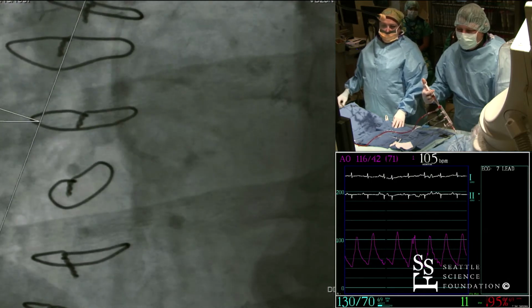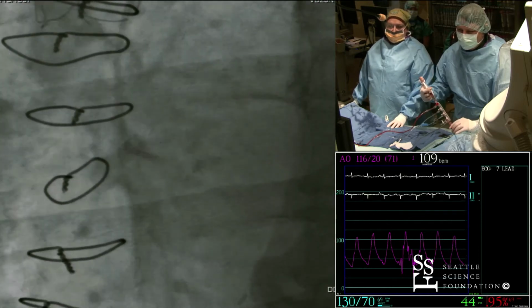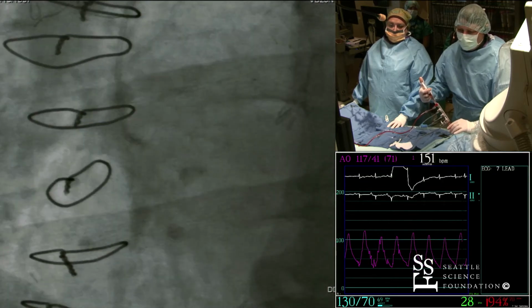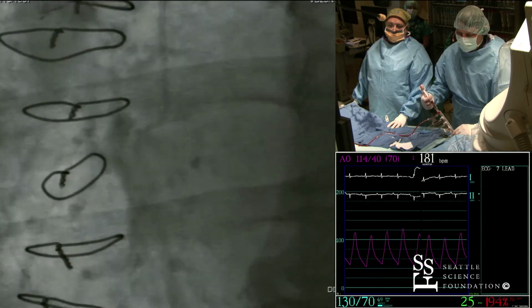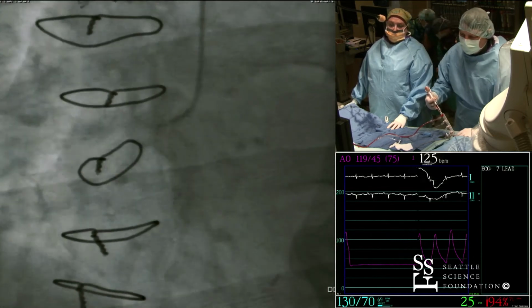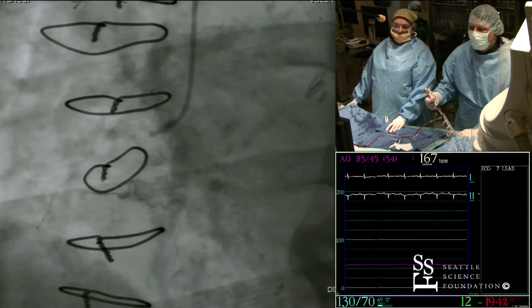Now, in terms of torquing the catheter, I still start doing what you normally do from the groin, but sometimes that's wrong, and sometimes you need to find out that you need to torque the other way. It depends on how the angles torque off of the catheter there. Let's see, am I in the coronary or not? Nope. So another advantage of the left wrist is that your catheter manipulation is just the same as it would be from the groin.